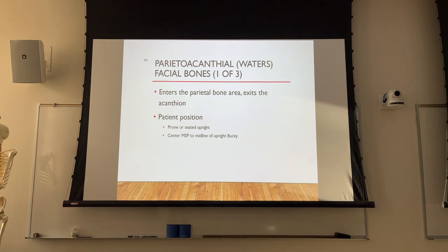If you look on page 65, it's perpendicular to the image receptor, right? But what we're going to have here is the orbital meatal line forming a 37 degree angle with the plane of the IR. So with the Caldwell, the angulation formed is the difference between the orbital meatal line and the central ray. With the Waters, it's going to be a 37 degree angle between the orbital meatal line and the image receptor.